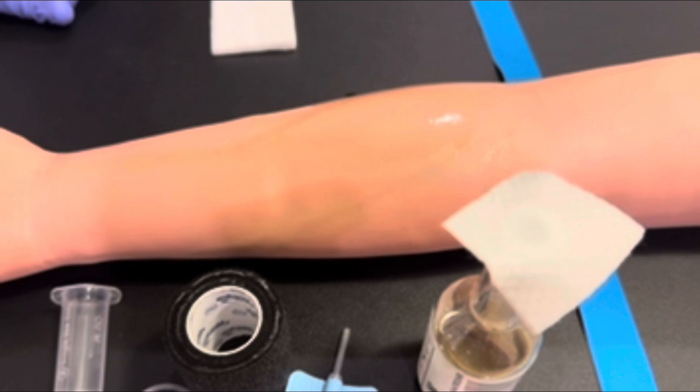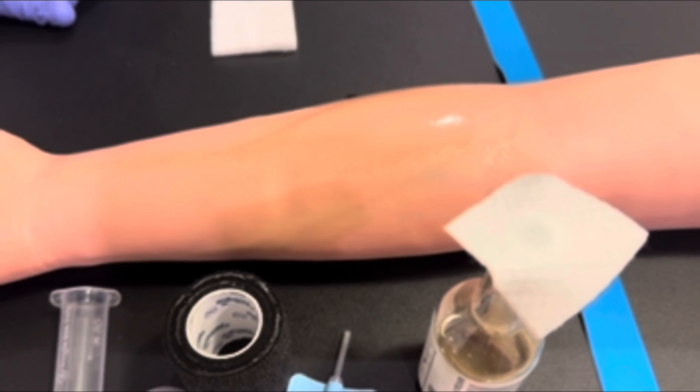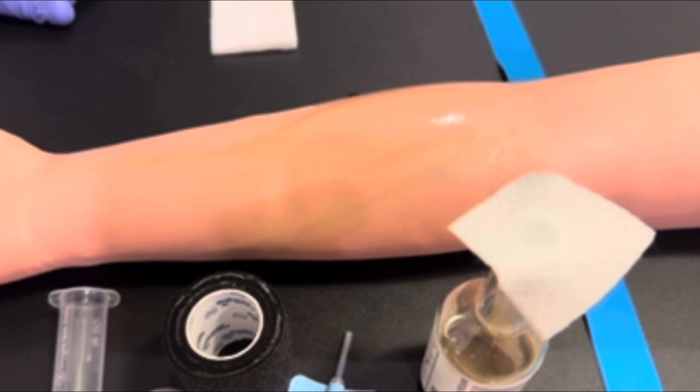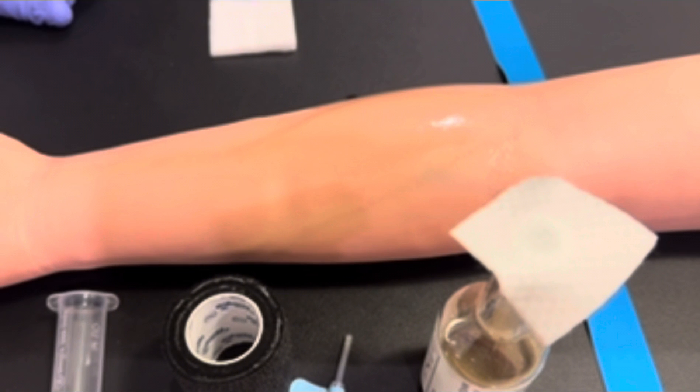Allow the venipuncture site to dry prior to performing the venipuncture collection. Please do not repalpate the site.